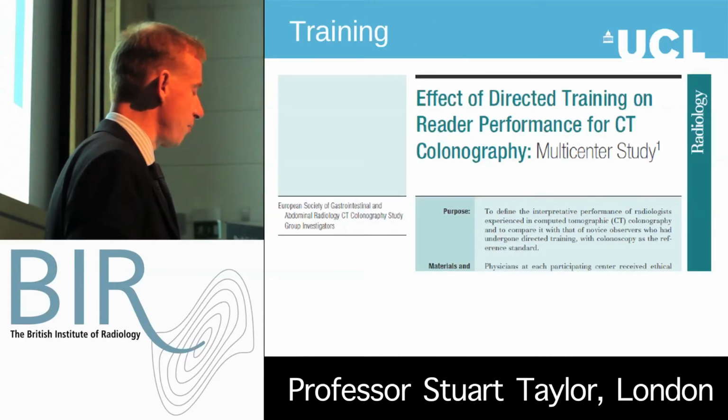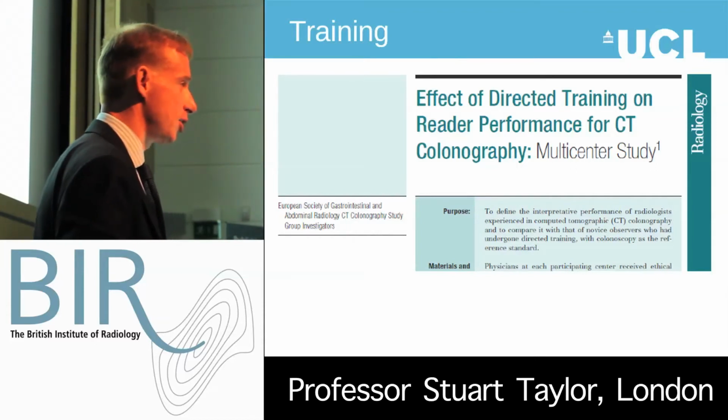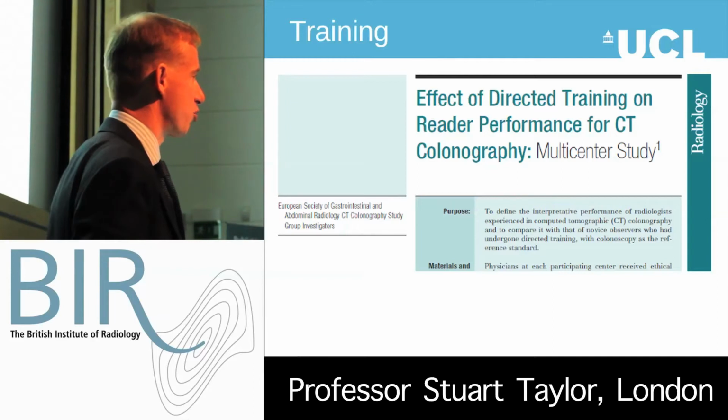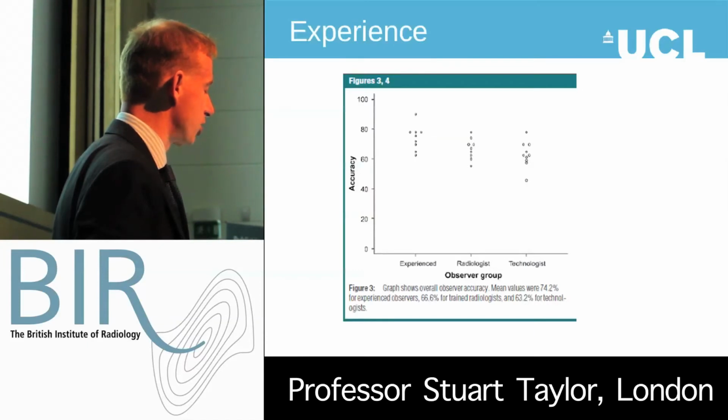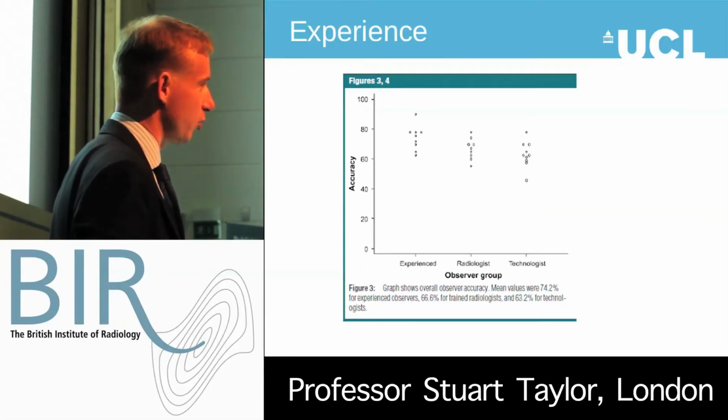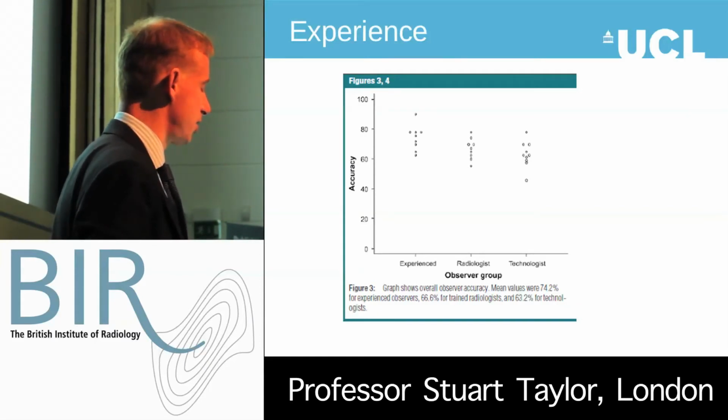And this has been shown by the ESCAR group that if you're expert in CT colonography, you tend to do better than if you've been trained but haven't done that many examinations. There's a wide variation in performance. So some trained radiologists and radiographers do actually better than so-called experienced people. So you'll find, like anything in radiology, you're good at some things, you're not good at others. And you might find you're good at CT colonography or you're not so good. It's just down to your individual skills.